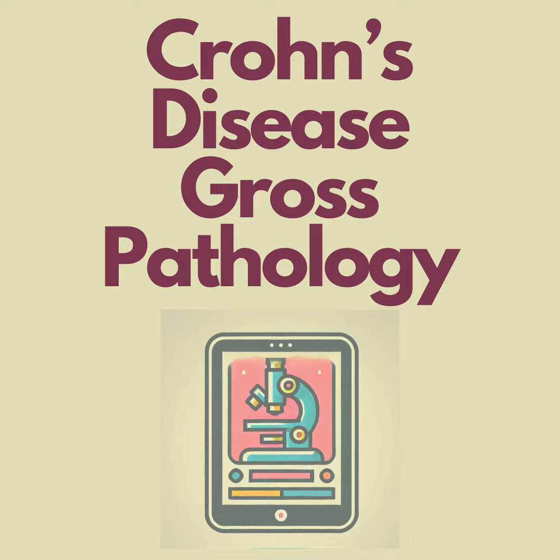So it's really a combination of macroscopic and microscopic features that helps us to make the right diagnosis. Precisely. It's like putting together a puzzle. Each piece of information adds to the overall picture. And speaking of the microscopic world, we talked about how part of grossing the specimen involves looking for fistulas. We've gone from the macroscopic features of this colectomy specimen all the way down to the microscopic detail. And we've talked about some related conditions like microscopic colitis and diversion colitis. Exactly. And we've even discussed the challenges of those indeterminate cases. It's been a really comprehensive deep dive.